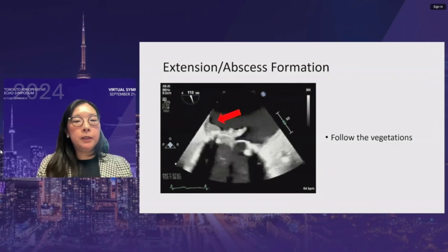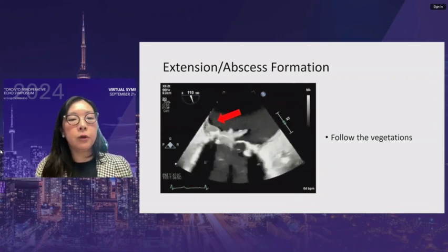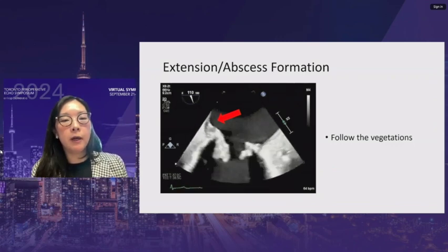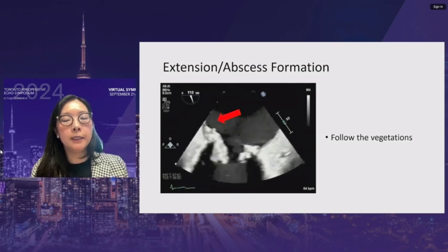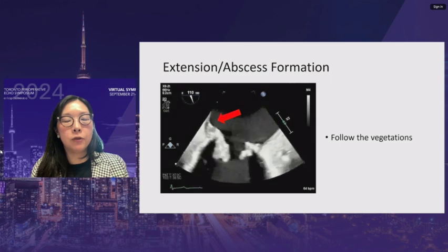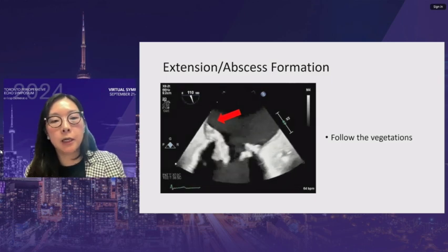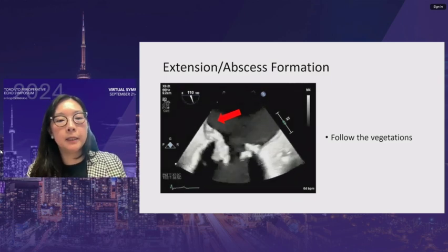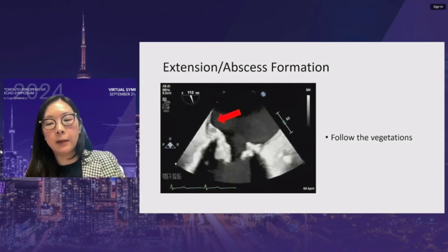When examining vegetations, sweep along to assess extension. This bioprosthetic mitral valve is infected, with vegetation covering the entire leaflet on both sides, extending across the annulus and up the atrial wall. It is important to look for extension into the annular areas, as this is where abscesses will form.